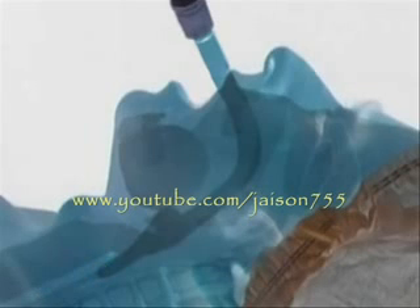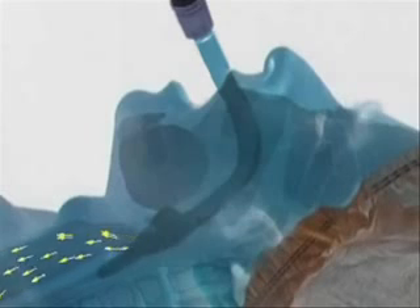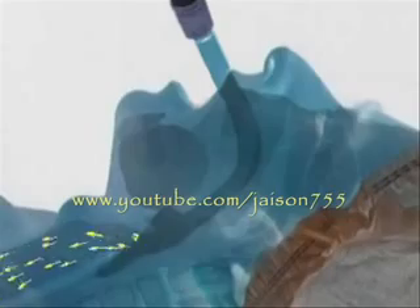The tip of the cuff is now sitting over the oesophagus, which is acting as a form of partial stopper either against reflux coming up or possible minor leakage of gases into the stomach. The epiglottis is resting over the top of the cuff, and the whole of that section is now completely filling the pharynx — a special feature of the laryngeal mask airway — because now the nitrous oxide or other gases are being directed solely through the trachea and into the lungs.